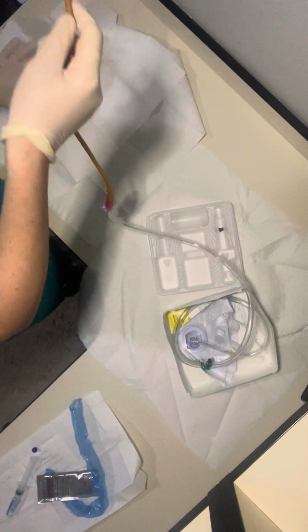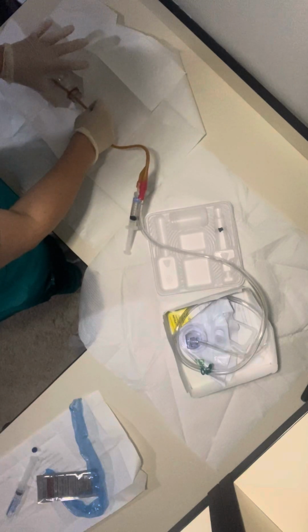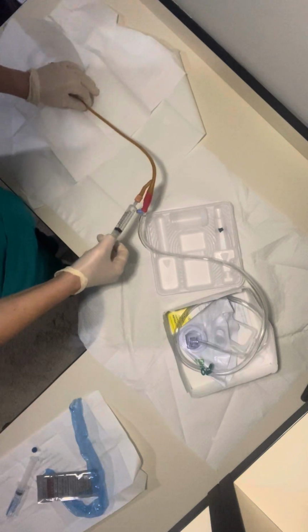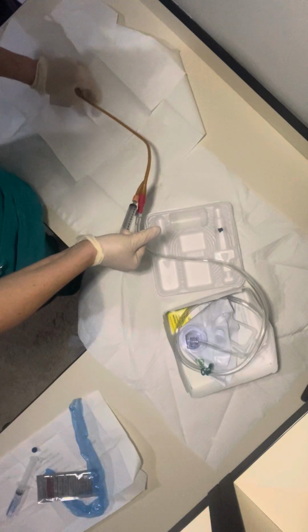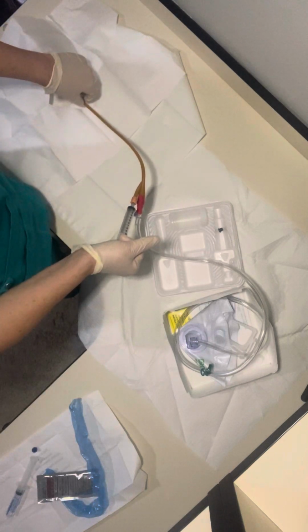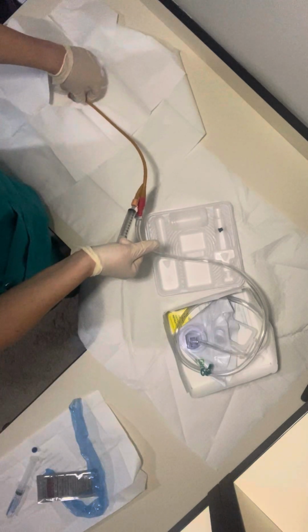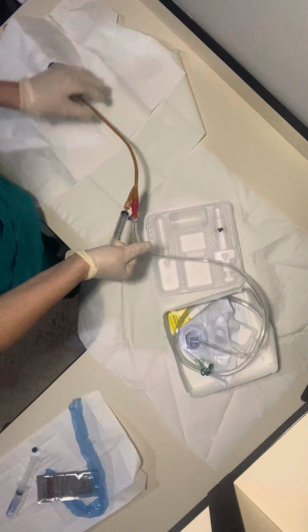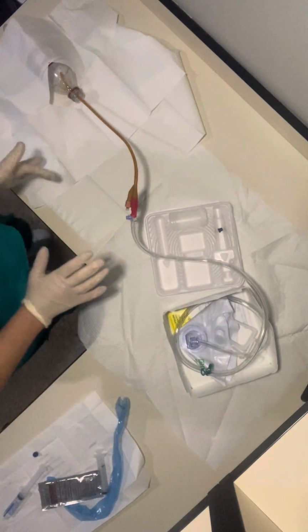Okay, so at this time, we're going to insert the catheter. So we're just going to go in a couple of inches. And then once we see urine, we're going to hold it in place with our non-dominant hand. We're going to inflate the balloon. Okay, and then once we see urine, we go in another little bit further. After you get the balloon inflated, you pull back just to make sure it's not going to come out once you release it. And so then we'll release it. Okay, and so at that point, our sterile field is complete.